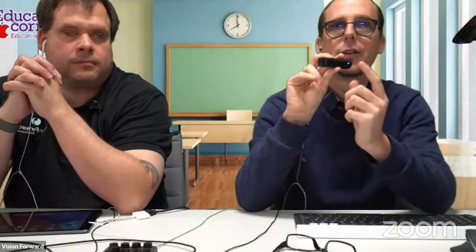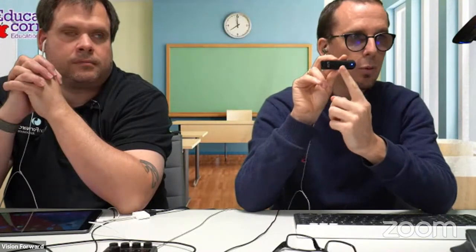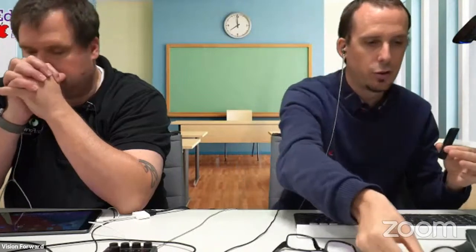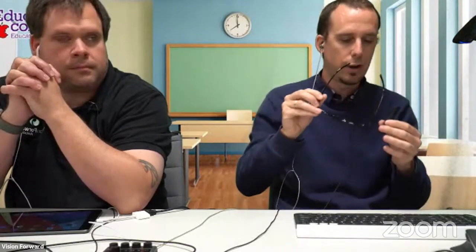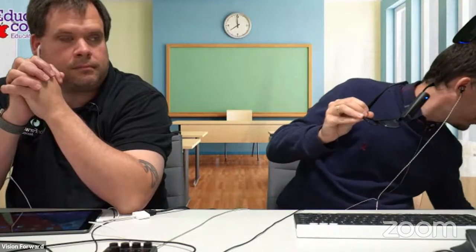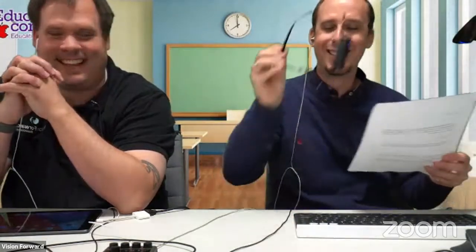So this device, we have a touch bar, and we can operate it using the touch bar, but we can also use gestures. Allow me to demonstrate here. Okay, and it may be a little hard to hear this just because of the nature of the device, but let's give it a try. So I'm going to put the camera on the glasses. I need to find that piece of paper. Oh no, it's trapped in the Connect 12. We both need it. There you go. Okay, wow. Okay, so here we go.